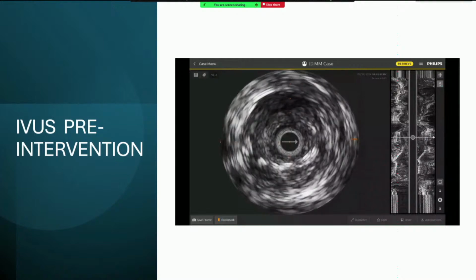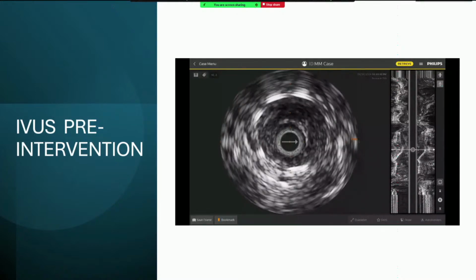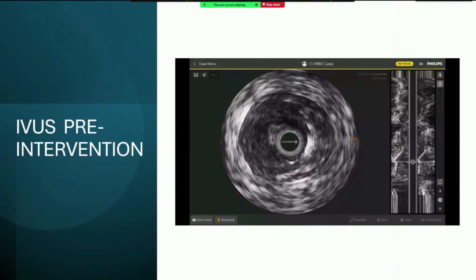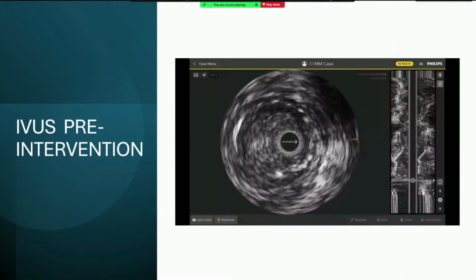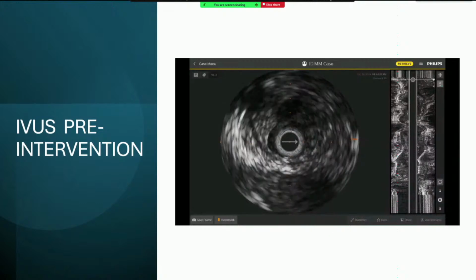And here we are in the interwoven Supera stent, which is ongoing here. It's all thrombus material and some plaque. And then we reach the still thrombotic occluded P1 segment where the stent has already finished. So there is just the vessel wall to be seen. Okay, thanks. And the next slide, please.